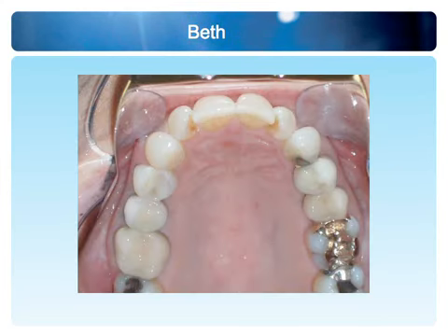As we move through the photos and we look at the upper arch, we certainly like to focus on this picture. It's my favourite picture. Looking into the upper arch gets me started. Remember, secret number 1 is the maxillary arch is the key. Now, if we look at this photograph, it's very easy at a glance to be hypnotized by those two teeth, the upper laterals. And what I mean by hypnotized is looking in there and saying, wow, there's just two teeth out of place, the upper laterals. They look like they need attention. That would be a little bit short-sighted because the reality is 14 teeth are out of place here.